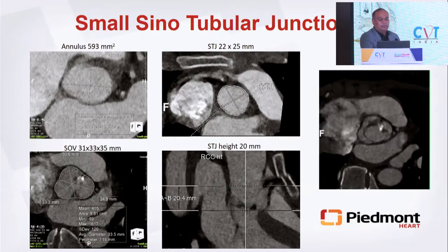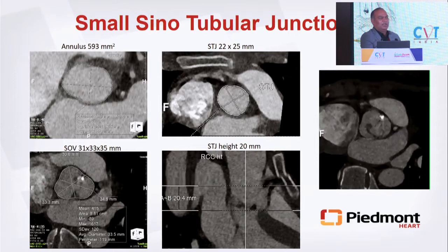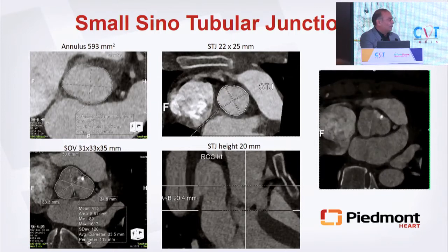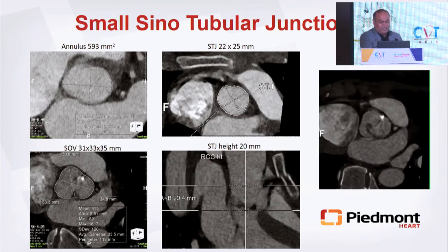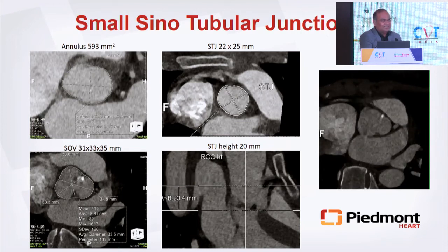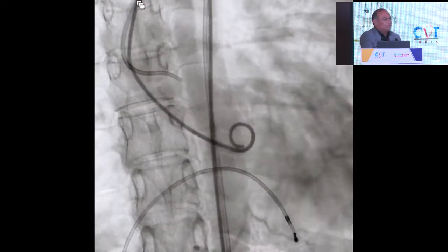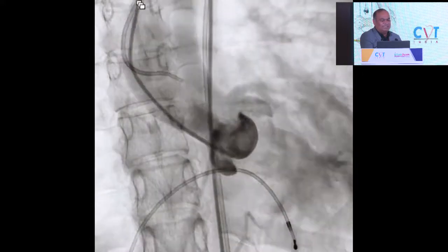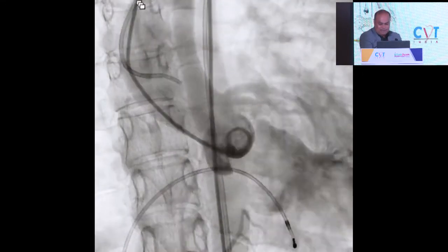Small sinotubular junctions. Like this case, annulus is 593, so clearly a large 29 Sapien valve. Big sinuses, however, the STJs are 22 and 25. Coronary heights are okay, just the issue is the STJ is small. It's a Sievers 1 bicuspid valve. And there's an aortogram that shows no surprises. We just see narrow sinus, narrow STJ, big sinuses. And the problem is the Sapien will hit the STJ.